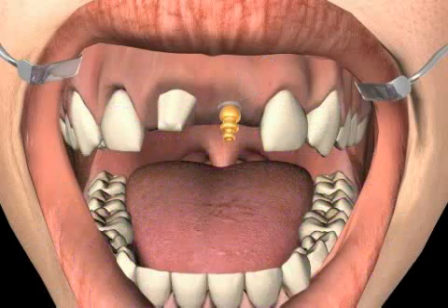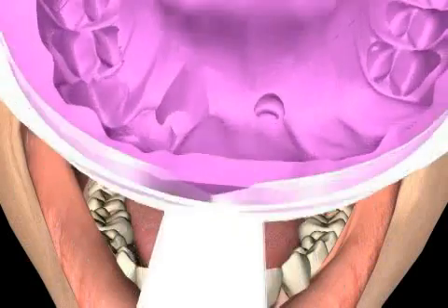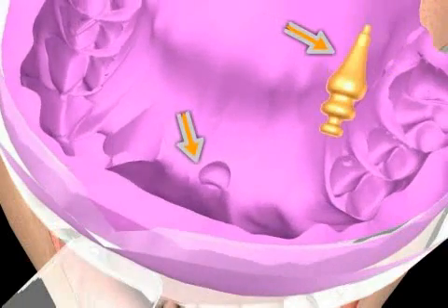Only now is the impression rod unscrewed from the implant and repositioned on the hardened impression. Hence the name: reposition technique.